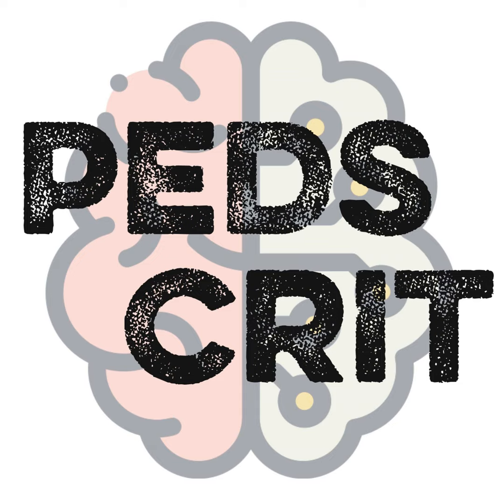Well, pitfalls and complications. I think if you are a novice or relatively new in using the oscillator, one of the biggest mistakes is when you do a recruitment, you do it too fast. You don't take enough time between the incremental pressure steps because, as said in the beginning, it takes time for the pressure to really open up the lung, and the time constant of alveoli is so much different. So that's a commonly made mistake. Another commonly made mistake is, when the patient is stabilized, not doing aggressive weaning, so really keeping the patient on high mean airway pressure.